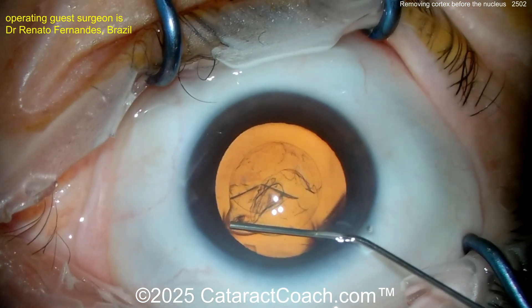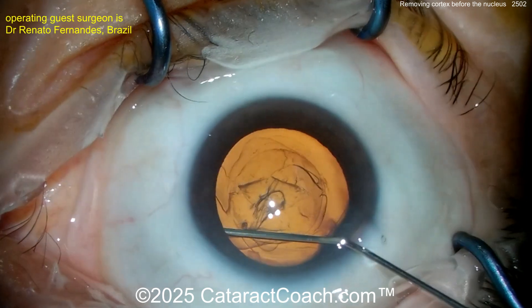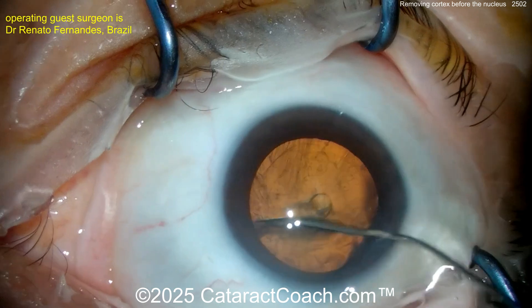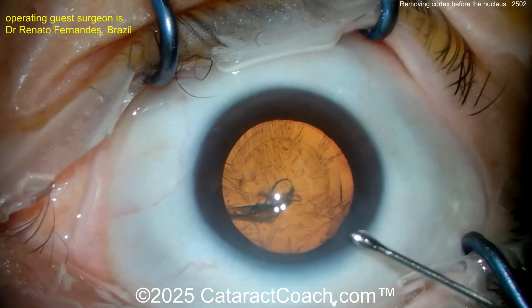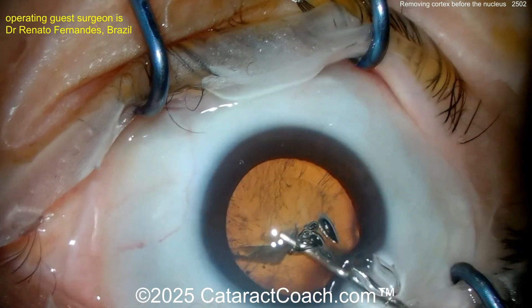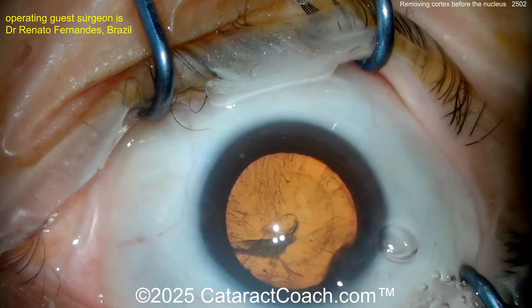Here's the hydrodissection. You can try some cortical cleaving if you want, tending up that lens capsule. As you have the fluid go across, that helps to separate. Remember, you want to separate the capsule from the cortex, not just the cortex from the nucleus. Now injecting some more — looks like viscoelastic — to protect that cornea.